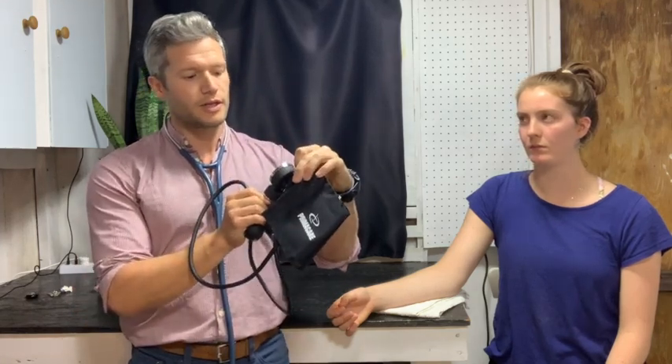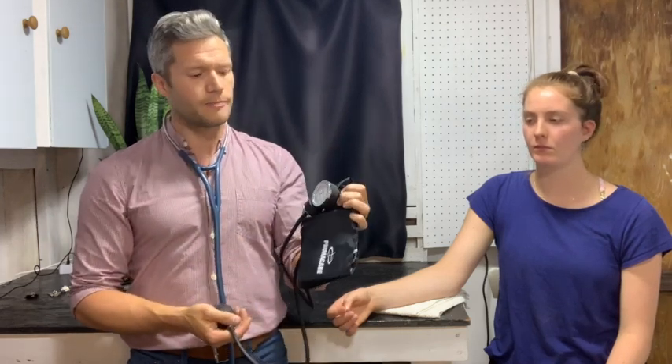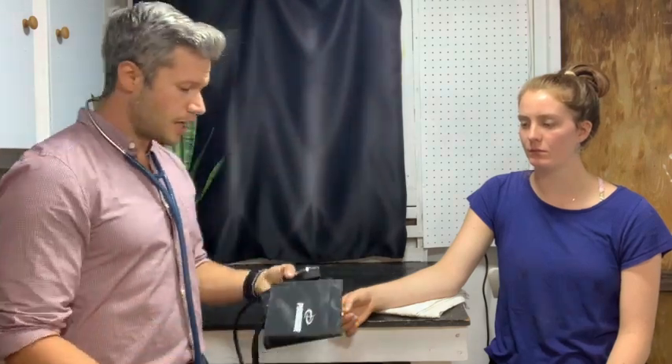Your blood pressure cuffs will probably have something similar to this, where the valve meter essentially has a little clip and a spot on the cuff that you can place it — that's just a way to manage the meter aspect of this. When I'm doing this in class, I'll typically let your partner or volunteer hold on to the meter. But it's much easier to practice with it on the cuff because when you're working with clients or patients, you're not going to ask them to hold on to things. There are going to be markings and different indications on the cuff itself, and before you start taking someone's blood pressure, it's always good to familiarize yourself with that.